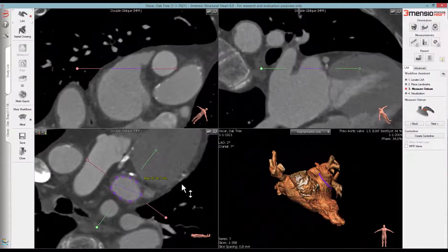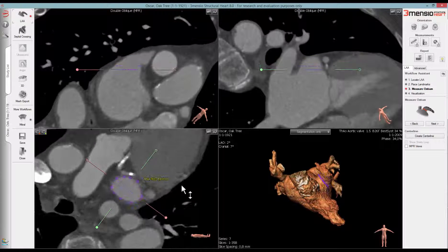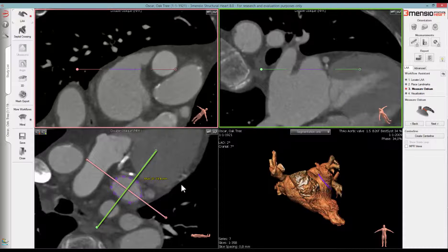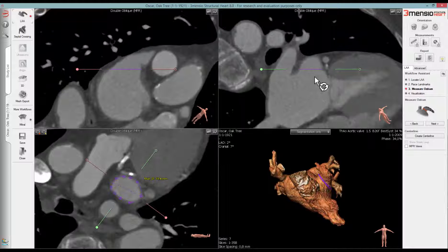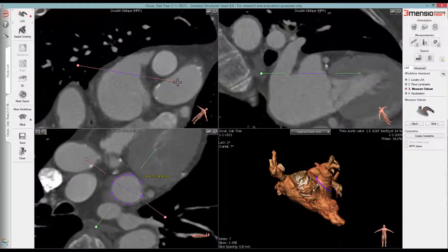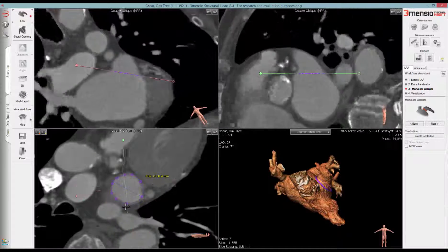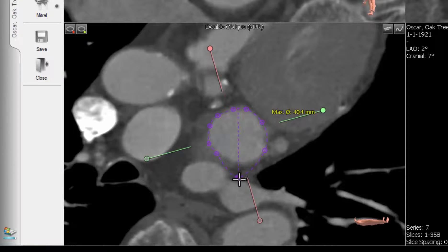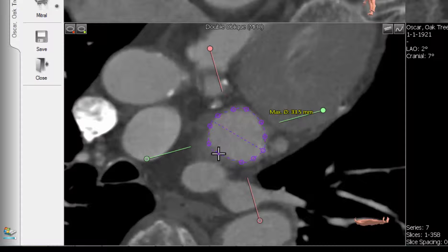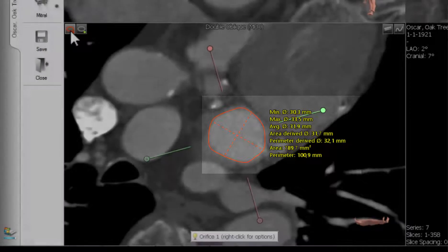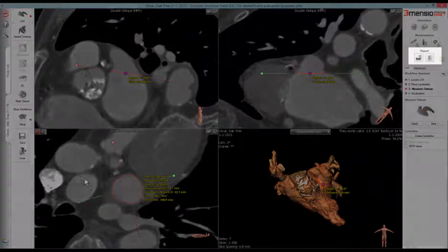On the left bottom viewport, we see a cross-sectional view. Using this view, we can move the ring over the LAA. A predefined segmentation is also shown, and the view contains a crosshair with the crosshair view shown on top. Use the top fuse to place the LAA ring at the ostium of the LAA. Drag the line to the correct height and tilt it using the circles on the ends. Rotate the crosshair in the perpendicular view to assess the ostium in all directions. Adjust the control points if necessary by dragging them to the correct position, and add a control point by clicking on the line. To measure the dimensions of the ostium, click on the ring in the upper left corner — automatically, several diameters, an area, and perimeter are measured. A screenshot of these measurements can be added to the report for a full overview.